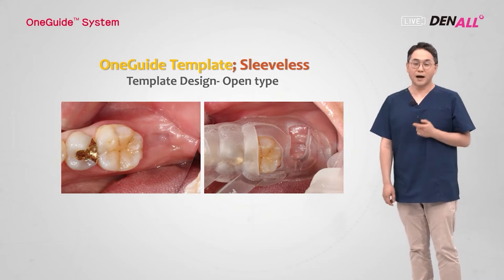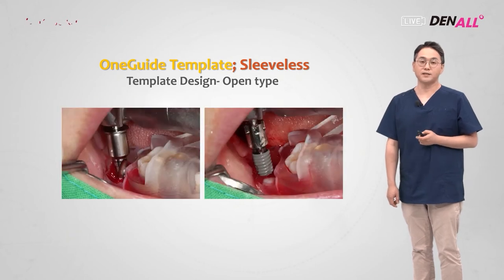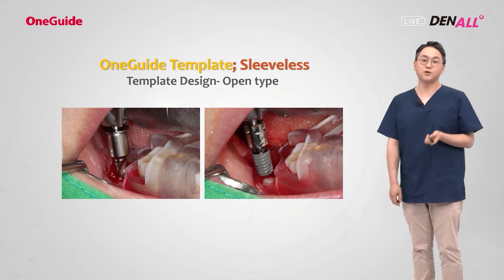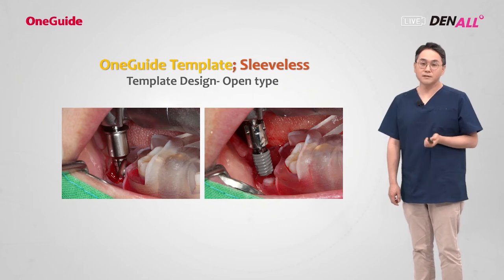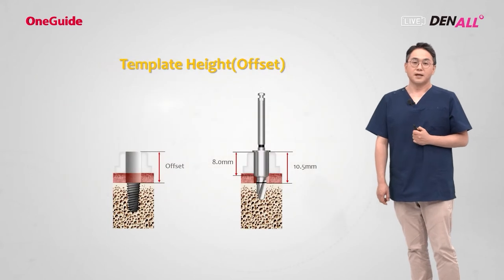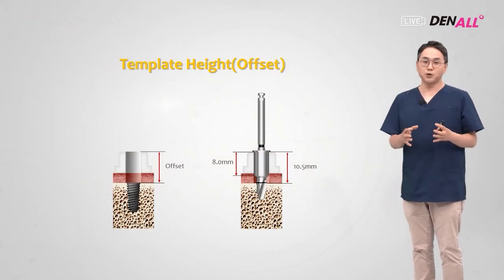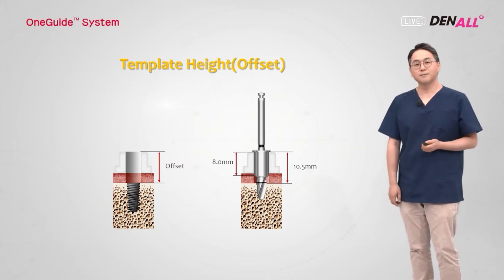In the most posterior region in the mandible, in this case, the OneGuide sleeveless guide with the lateral opening was designed. The drills and the implant access the site laterally, so the case was done in a very easy way. By changing the guide hole position, mesiodistal and buccolingual positions can be adjusted.